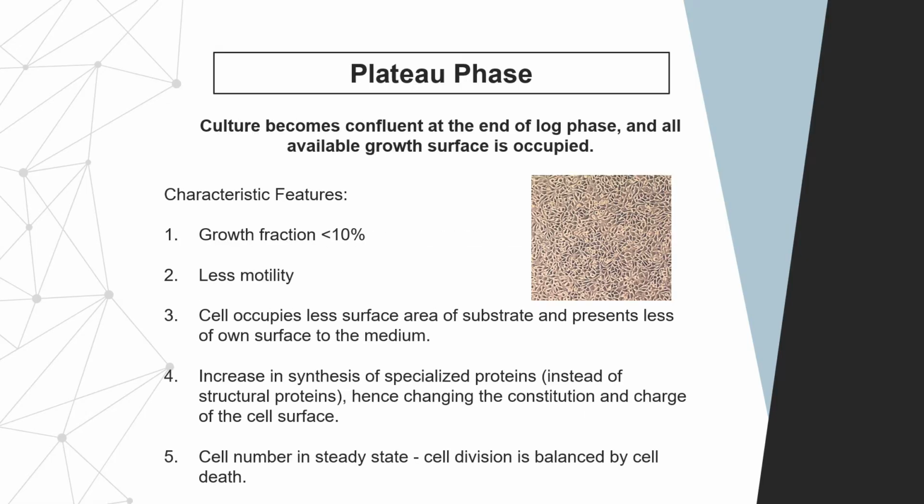At the plateau phase, the culture becomes very confluent. Usually this is at the end of the log phase, and all the available growth surface is already occupied. So some of you may have seen this in your practical classes.